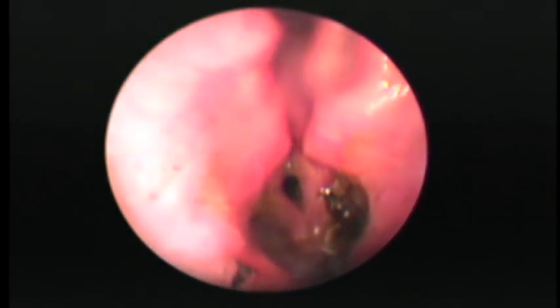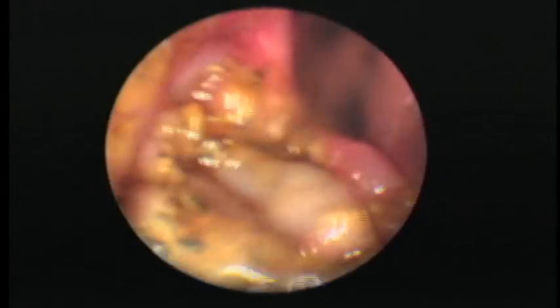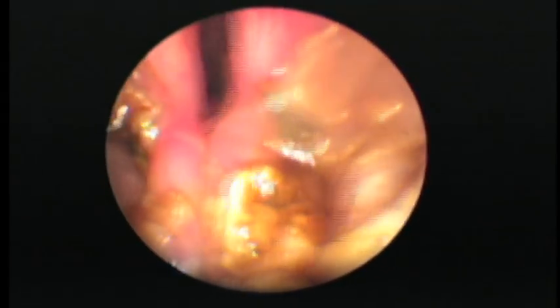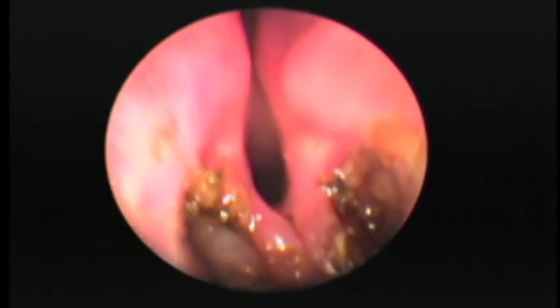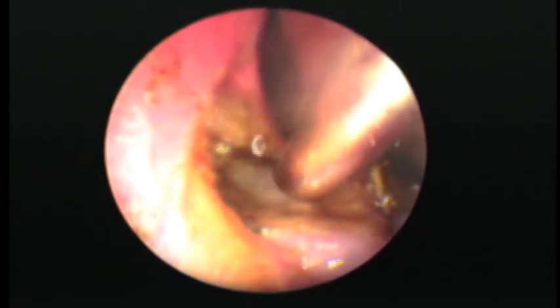Now you can see on the dog's left side, I don't see a saccule. But if you look on the right side, you'll watch it — it'll bug out of there when I bump it. And that's the piece of tissue that we want to remove. Eventually there's a little bit of tissue on both sides that we're going to remove. You can see how that's starting to creep back out around the vocal fold. We're usually pretty careful in these dogs not to hit the vocal folds when we use the laser.